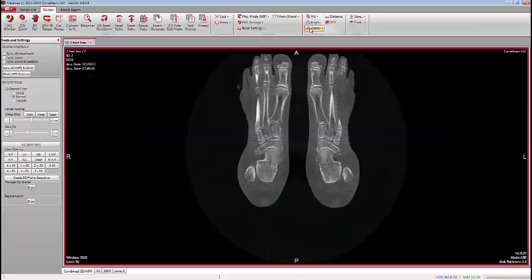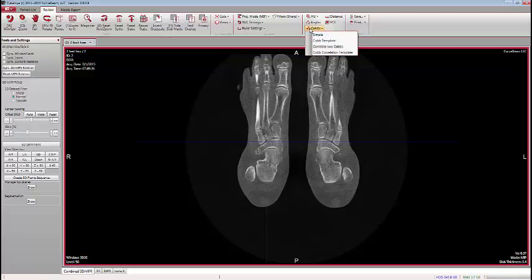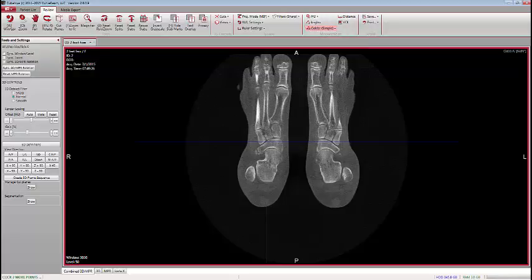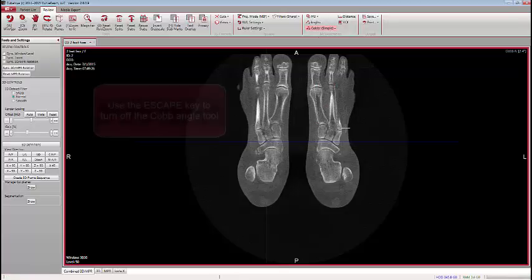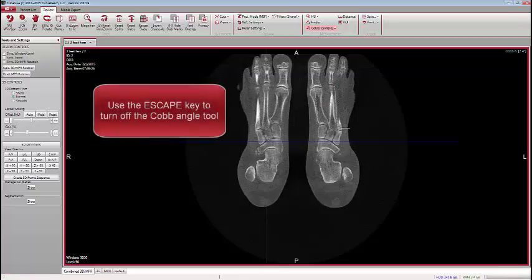There have been some modifications to existing tools in CubeView to make them easier to work with. For example, if you've ever drawn a Cobb Angle, you've probably wondered what's the best way to turn off that tool once you're done making your measurement. Now you simply hit the Escape key to exit the Cobb Angle tool.